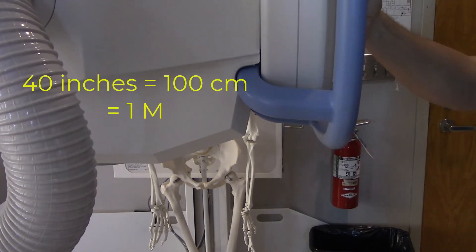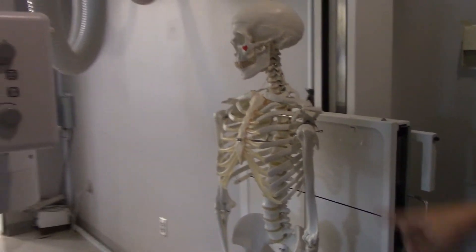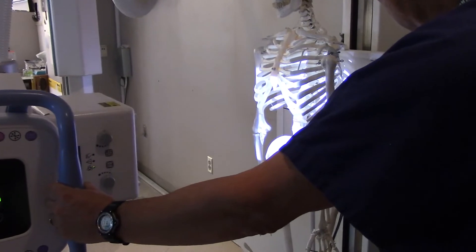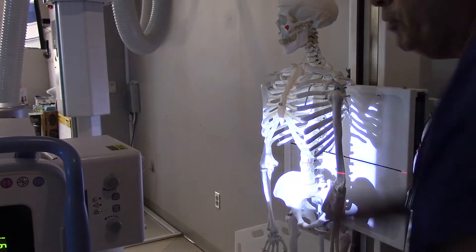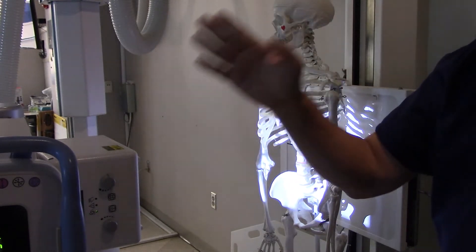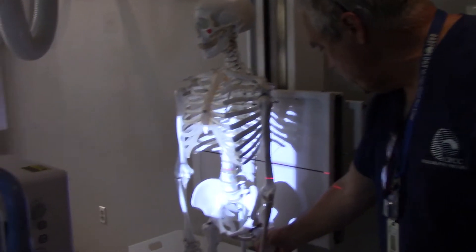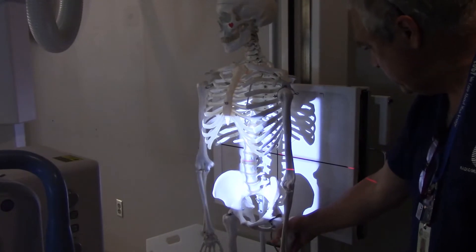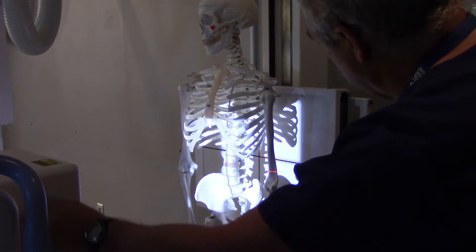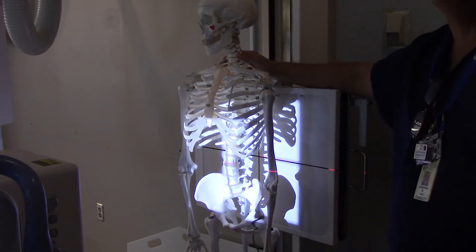The book says to use a 40-inch SID for this. Personally I use a 50-inch SID or even a 72-inch SID — that's going to get rid of a lot of magnification. Your clinical preceptor will tell you what is acceptable at that particular site, but if anybody asks you on a test question, it's 40-inch SID. We're just going to collimate down to film size, which the PBL has already handled.